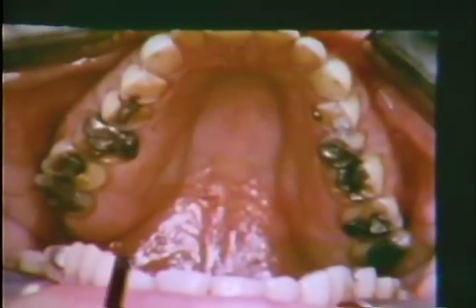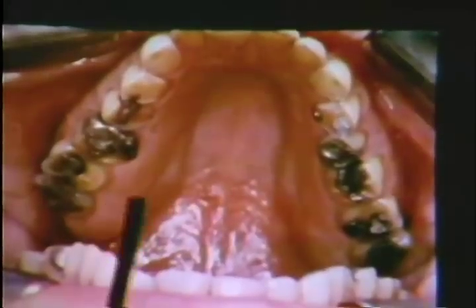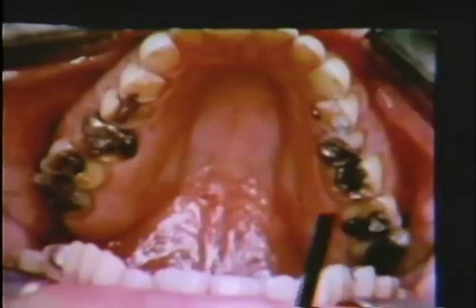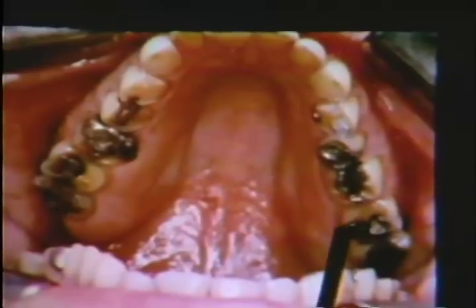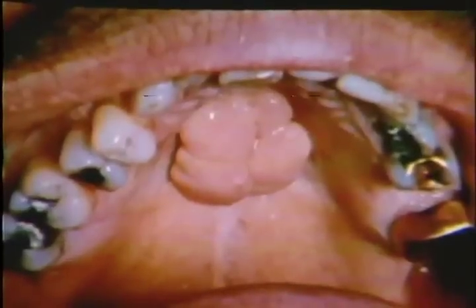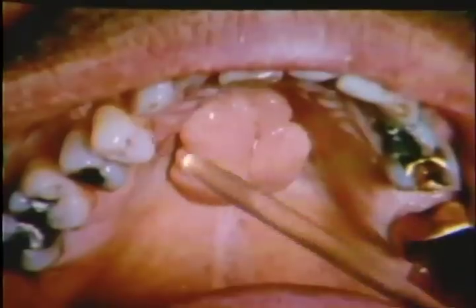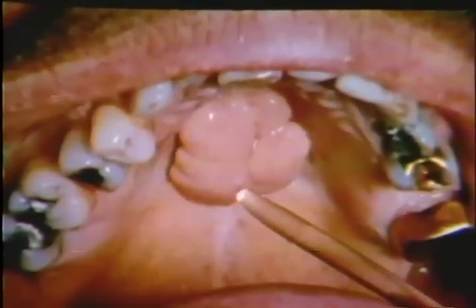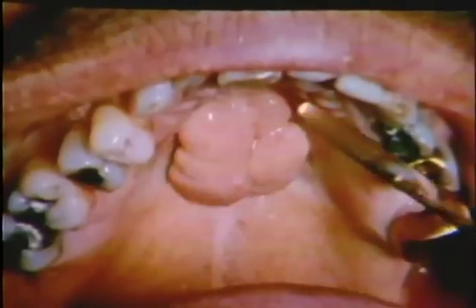In this case, the patient has a full complement of teeth quite well aligned, but the lingual aspect of the maxillary ridge is quite prominent and this could provide an obstacle to proper film positioning. In another patient, a hard mass of the palate is noted. This is a torus palatinus, a benign bony growth that may also interfere with proper film positioning. The film would have to be placed on one side or the other when radiographing the patient's teeth.